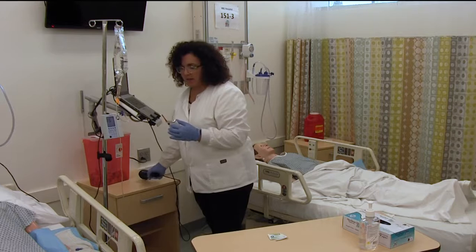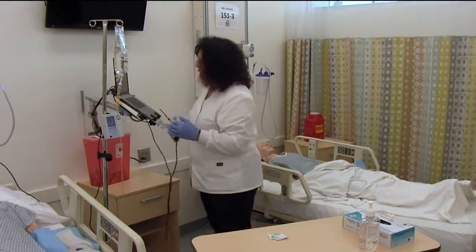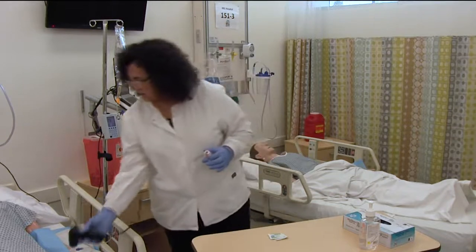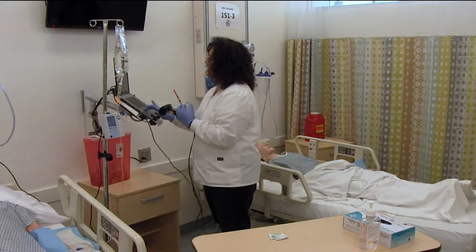So then, after I have done check 3, I go ahead and scan it in, press administer, I scan the wristband, and then I scan the medication.